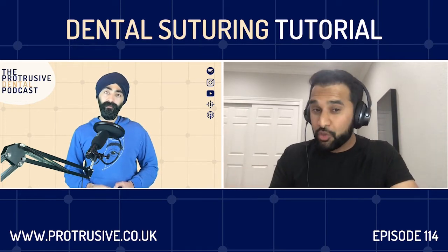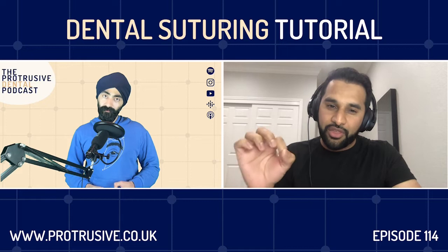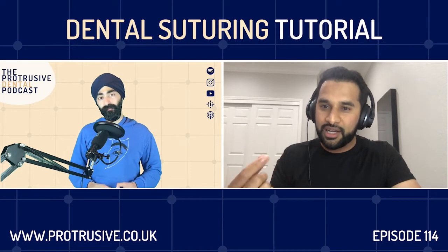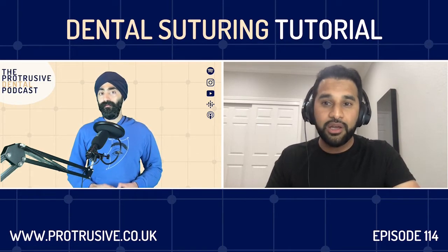3-0 is a good one, a 3-0 Vicryl, but what you'll see is the larger the suture is, the thread, you'll tear the tissue more. You actually want a smaller suture. So 3-0 Vicryl is a good one. One of my personal favorites is the 4-0 PGA.